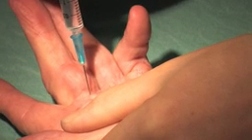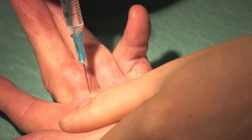The bevel of the needle that is to be used for the aponeurotomy is positioned so that the opening is in line with the graduations on the syringe to facilitate positioning. This ensures the surgeon is able to maintain the needle bevel perpendicular to the direction of the cord fibres once it is inserted into the hand.